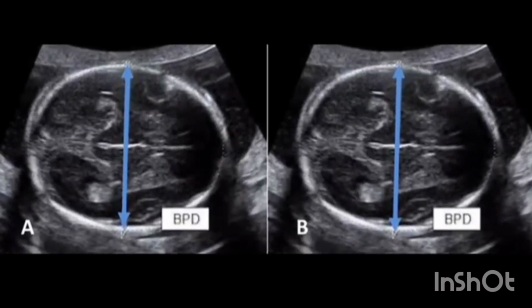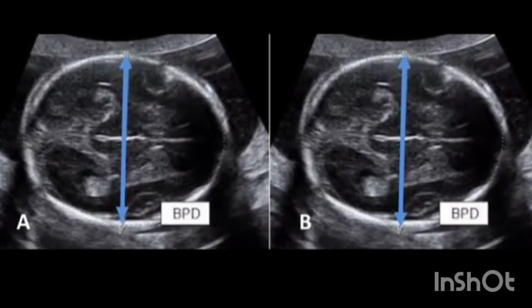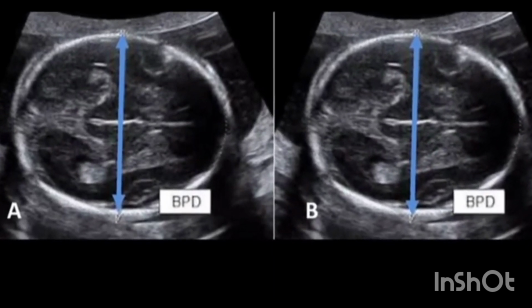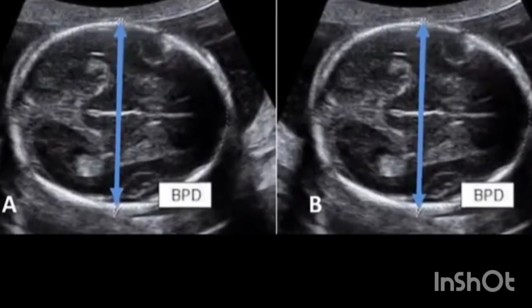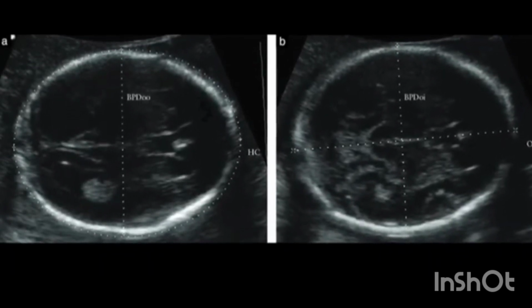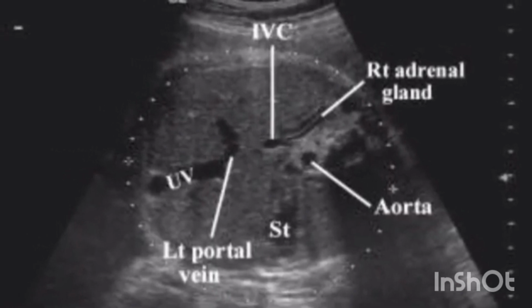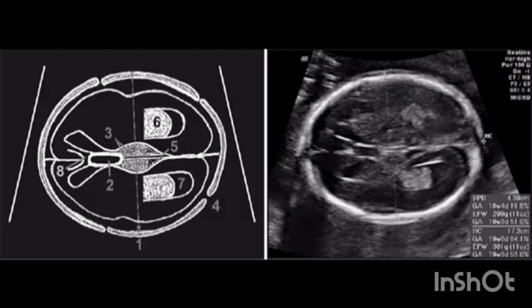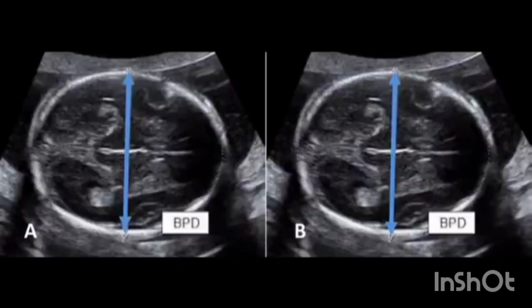Biparietal diameter is one of many measurements that are taken during ultrasound procedures in pregnancy. It is one of the basic biometric parameters used to assess fetal size. Biparietal diameter, together with head circumference, HC, abdominal circumference, AC, and femur length, are computed to produce an estimate of fetal weight. In the second trimester, this may be extrapolated to an estimate of gestational age and an estimated due date. It is a measurement of the diameter of a developing baby's skull from one parietal bone to the other.